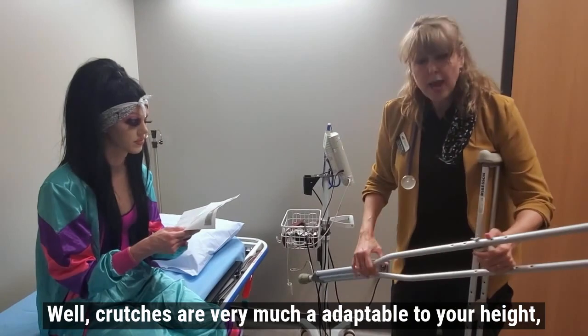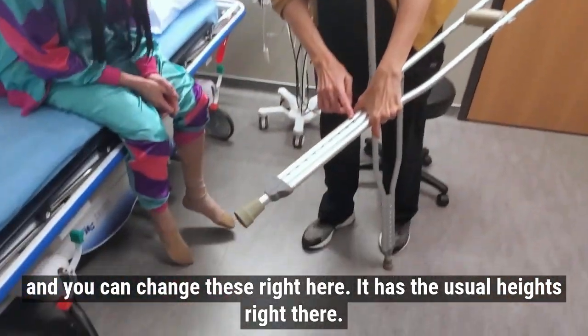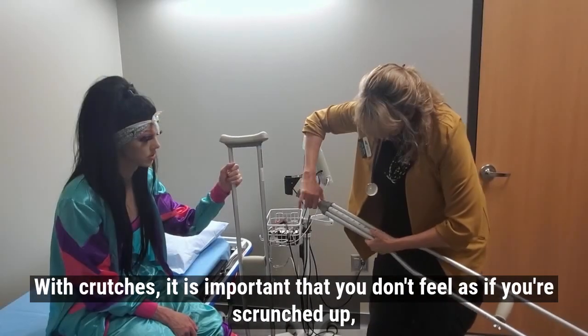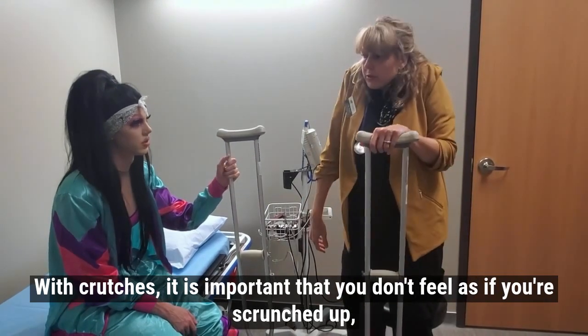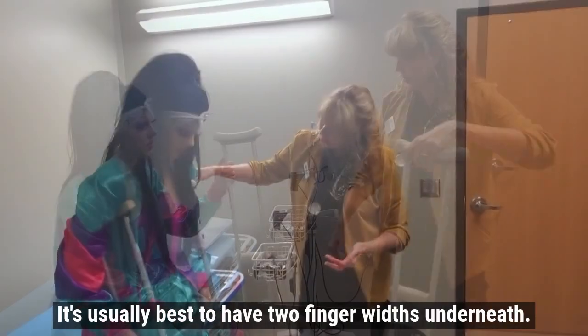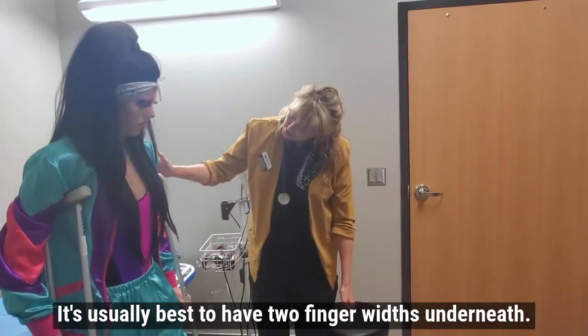Crutches are very much adaptable to your height, and you can change them right here at the adjustment points. It is important that you don't feel scrunched up, and it's also important that you're not bending over. It's usually best to have two finger widths of space underneath.